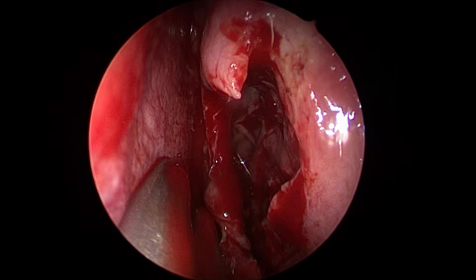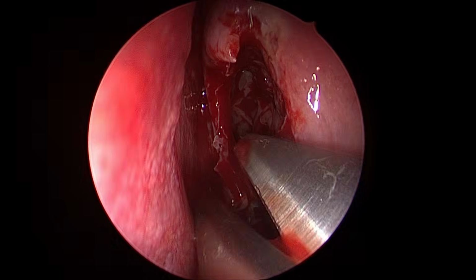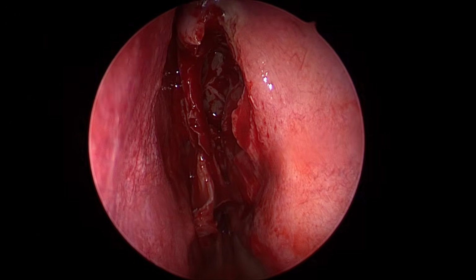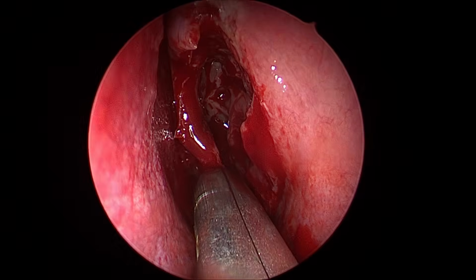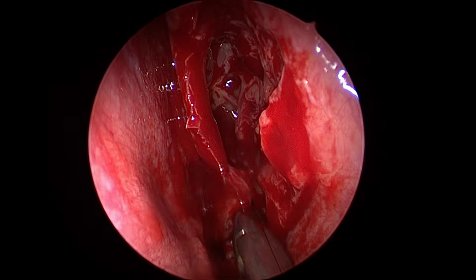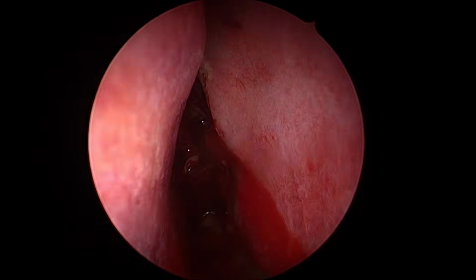Access of steroid to the olfactory region. This is the olfactory region. I am not going to be aggressive to this olfactory region, mucosal polyposis, edema, whatever. Because once the steroid reaches there, this is going to revert, even the olfaction can come back. But if you are aggressive and giving too much fibrosis there, you are ruining the prospects of olfactory recovery. So never ever be aggressive towards the olfactory region. Rather, be aggressive towards allowing the steroid to reach there by means of giving access.